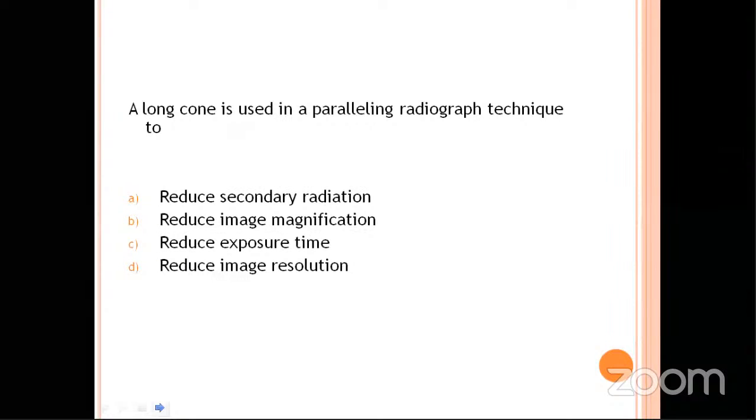Paralleling technique is not something we normally take. We use it with a separate device. So that is used to reduce secondary radiation, image magnification, exposure time, or image resolution. The option is it is used to reduce image magnification.